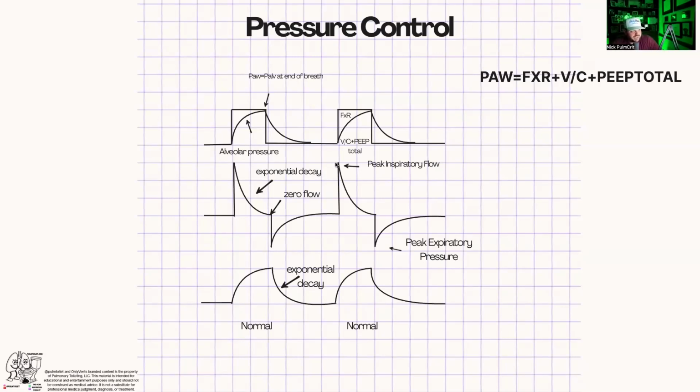So this is your peak inspiratory flow. So now your area under the curve. So this part, this kind of upside down triangle, whatever you want to call it. If I shaded this in, this would be the proportion of the area under the pressure curve that is due to the flow and resistive portion. Right? It's its makeup. And as you see, it gets less and less and less as you go through your breath cycle and as your lung fills up.